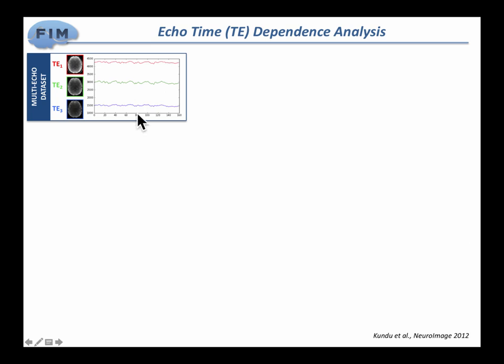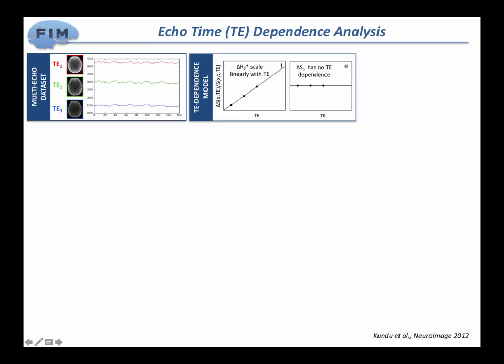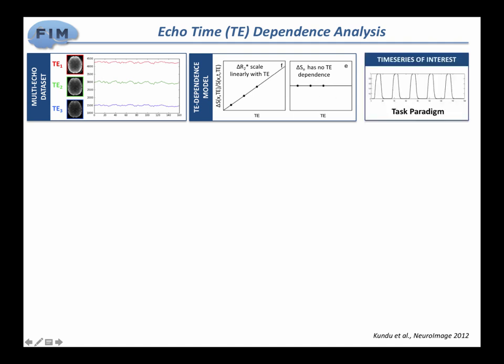But say you have some multi-echo data, like here, with 3 echoes, and now we have this idea about how the signals behave. Let's say we have, for example, in a given experiment, done a block design visual experiment, and we know that there should be some signal in there that behaves in this manner, because we imposed this block paradigm with 20 seconds of flashing checkerboard and 40 seconds of nothing.